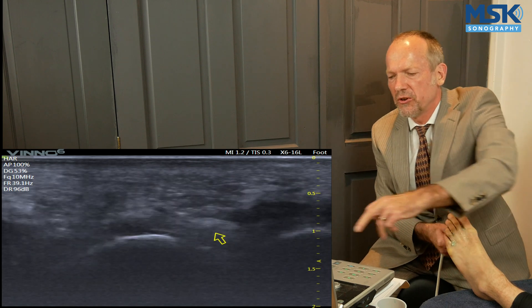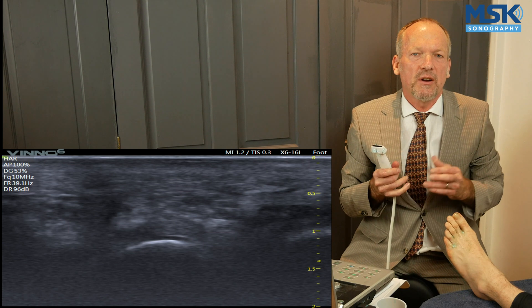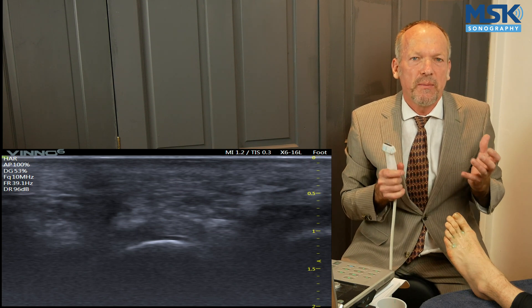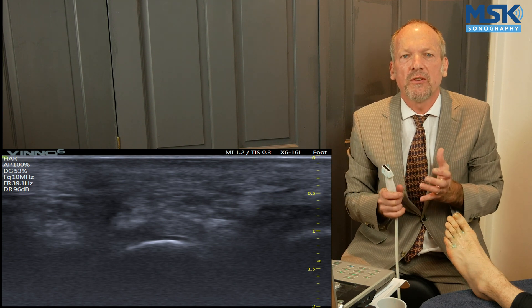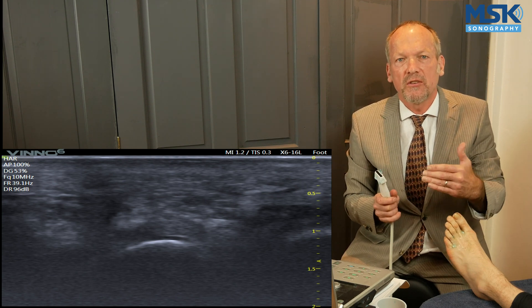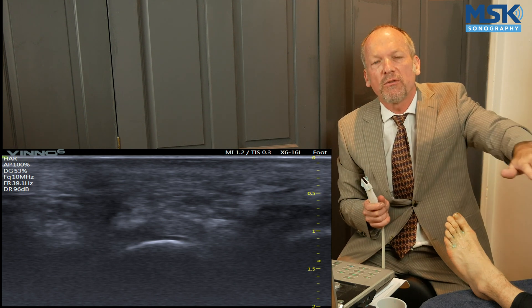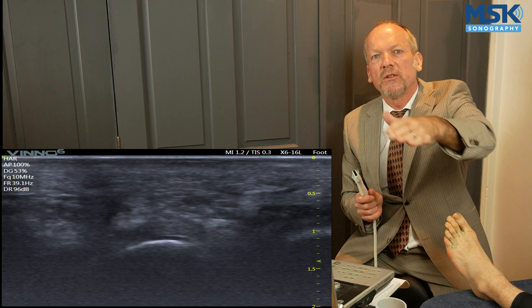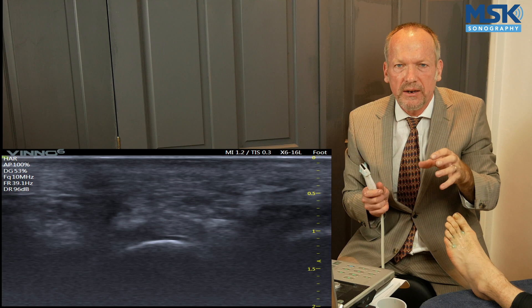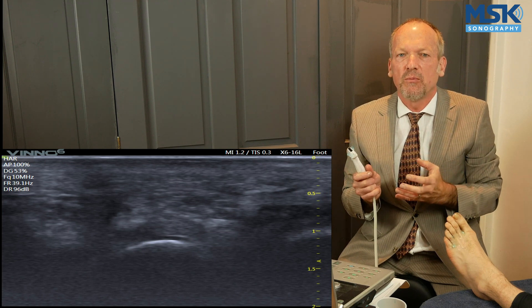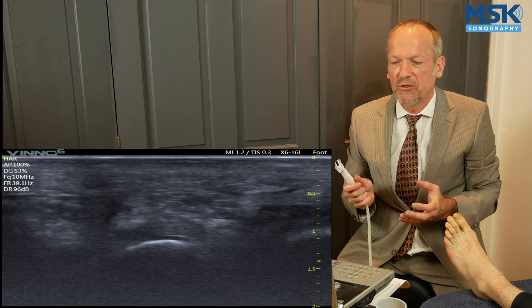So what I suggest you do in the first instance is just start following the plane of the metatarsal heads, trying to get them to pop up in the same part of the screen. Once you've achieved that, go into the space and start to look — superimpose in your mind the line of the nerve going from the far field to the near field. In that region, start looking at what the structures are like. Push around a little bit, try to get things moving, and you should start to make some sense of what would otherwise be a snowstorm. Now it's your turn to give it a try.